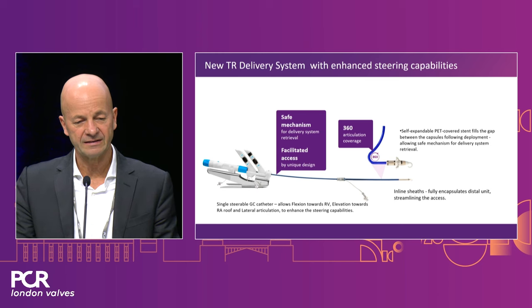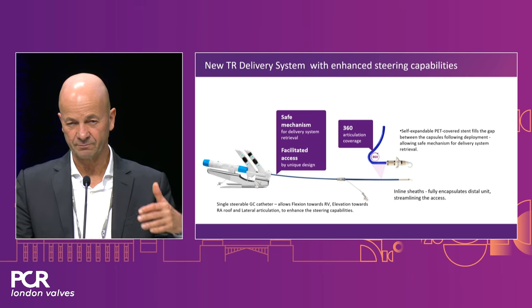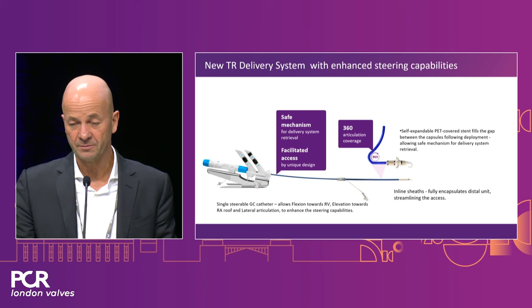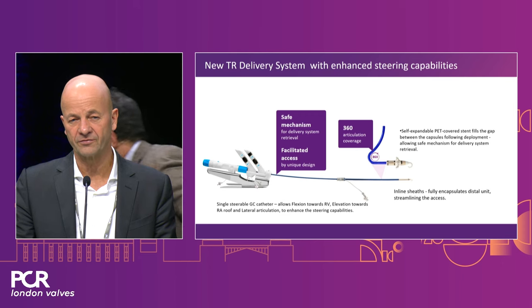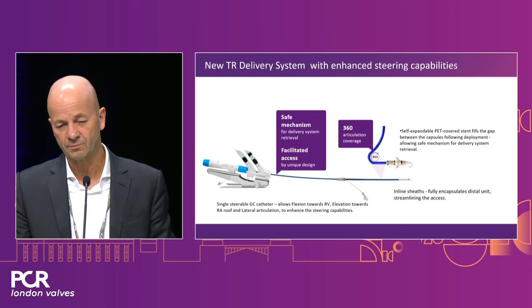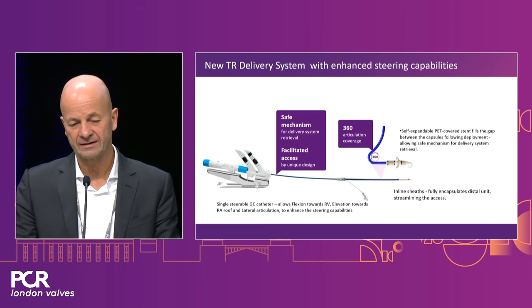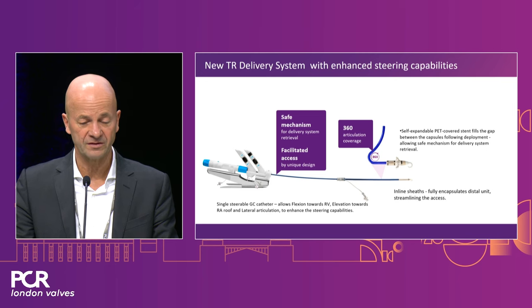Neil mentioned already the iteration. This is my last slide, the new iteration of the device. We have an inline sheath available, which makes the procedure percutaneously available, which is extremely important and comfortable for the patient and also for the treating physician. And we have this enhancement in the steerability of the guide. This is very important. You can gain distance to the annular plane. You have a lot of flex possibility, and you can also compensate for this hugger by going lateral with the device, and this will ease up the procedure quite a bit.